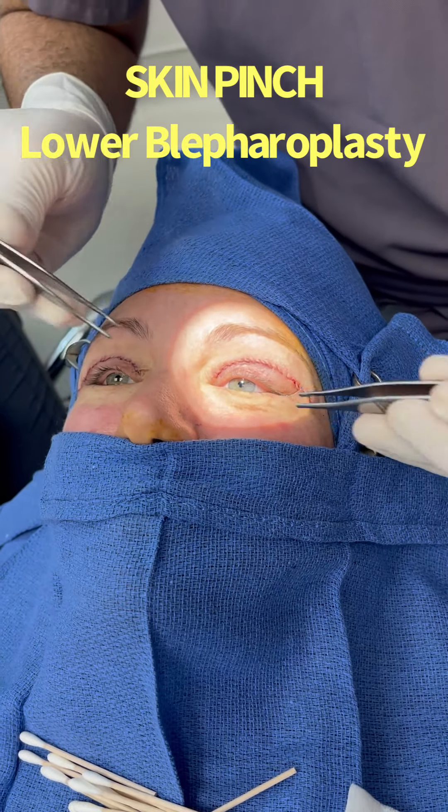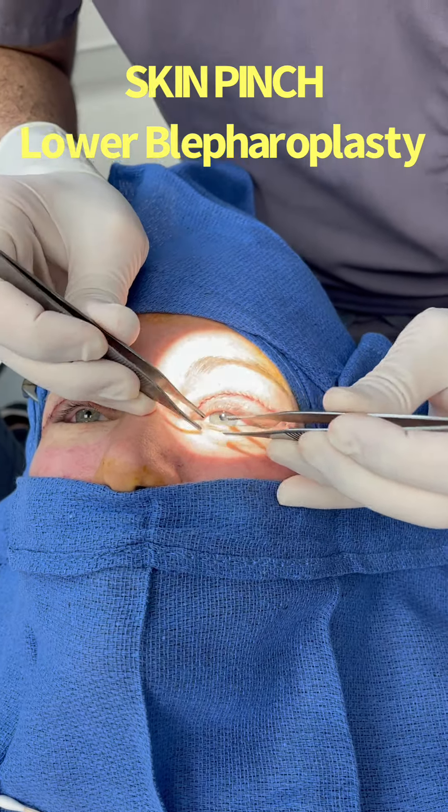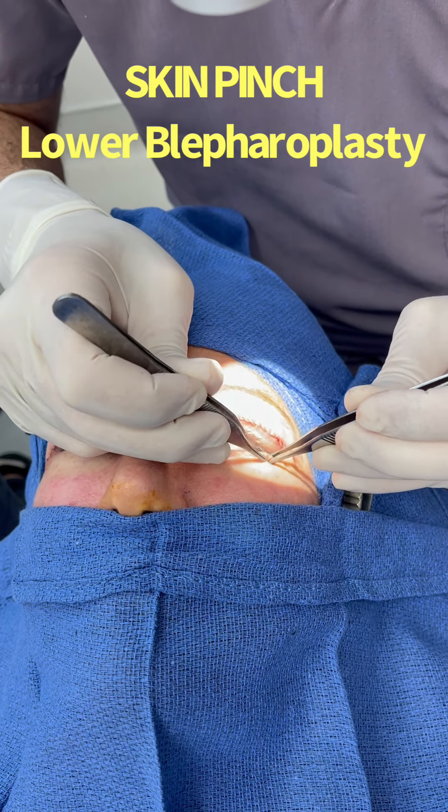A 45-year-old woman bothered by loose skin in the upper and lower eyelids. We're going to perform upper and lower blepharoplasty. Specifically for the lower eyelid, we're going to use a skin pinch method and remove about this much skin.